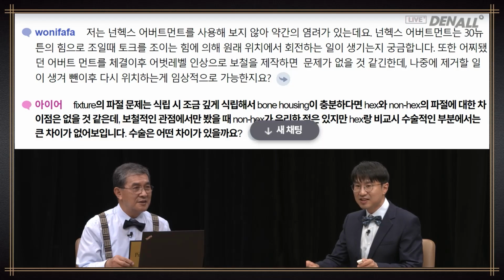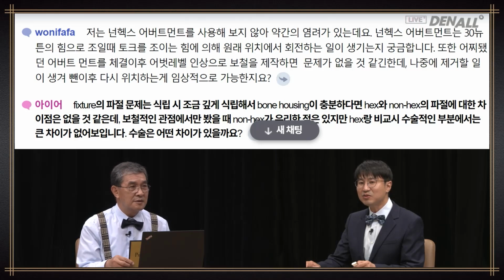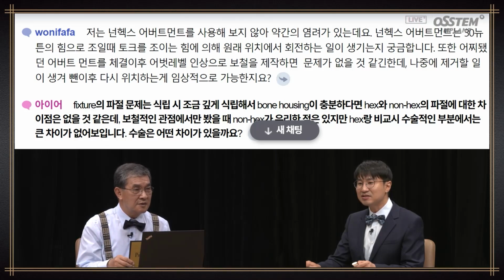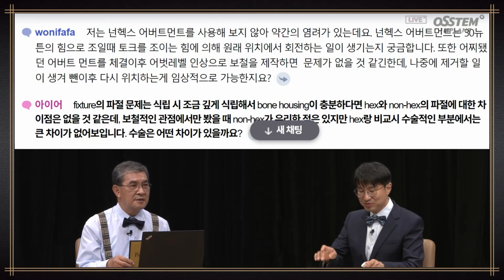I've mentioned it briefly. Non-hex abutment. You tighten with your hands. People all agree that after tightening with 30 Newton, even if you apply additional torque, it does not rotate. Most people agree on that. However, if you tighten with your hands and if you apply torque, whether it rotates or not, this is something that a lot of people are curious about.